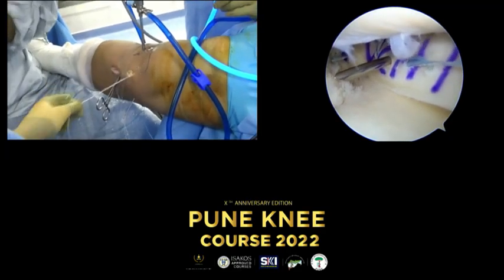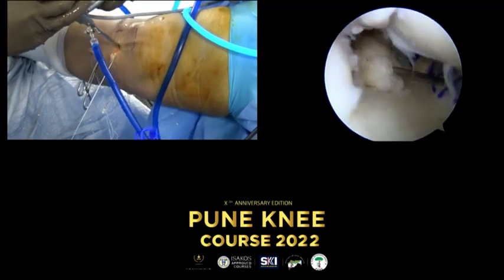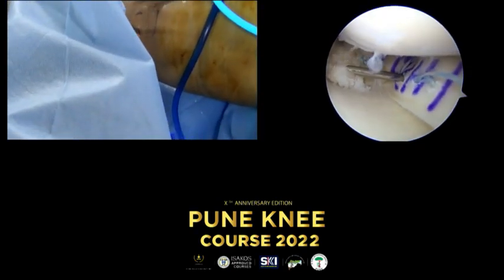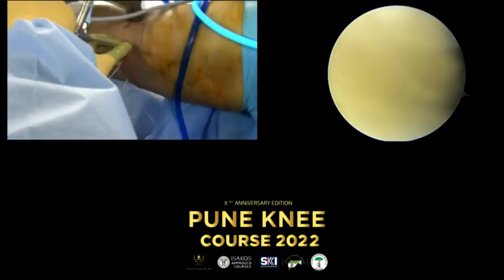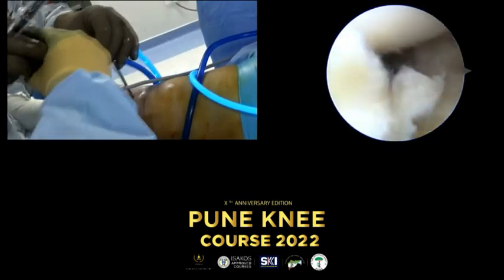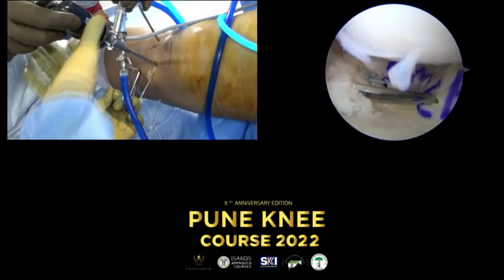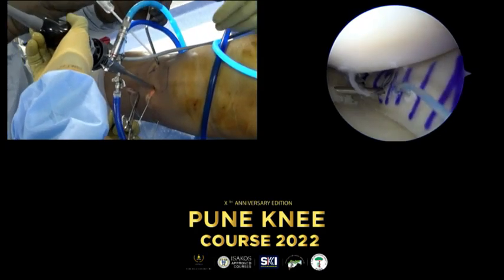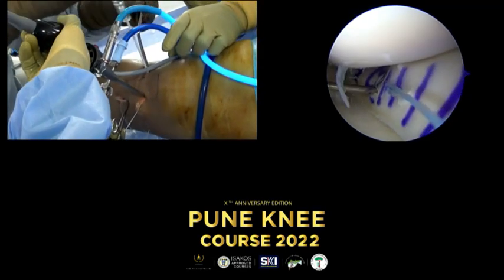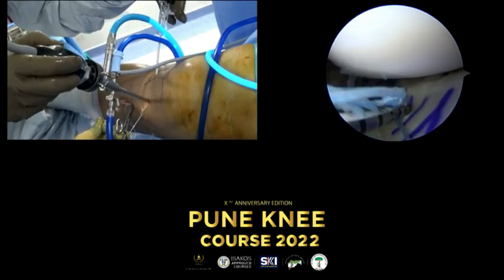You know what? Give me the all-inside. Can you hold the camera? I think now we are in the right position. The camera is now... Can I hold it? But you have to pull from here, otherwise... This is at 18 now. I hold it. I try to put it downward.